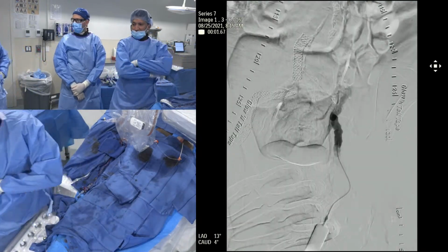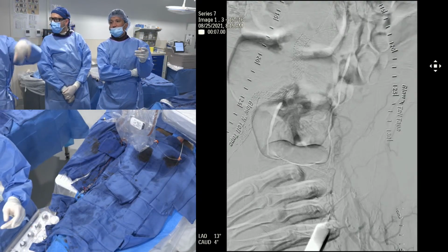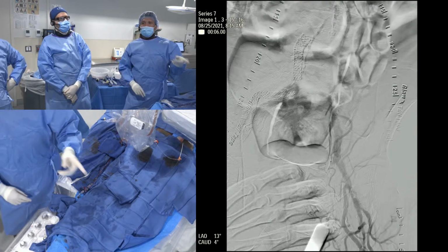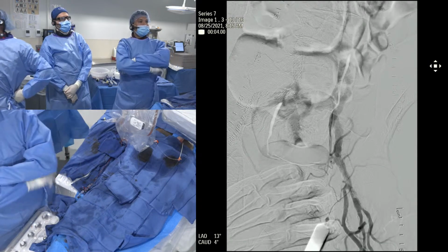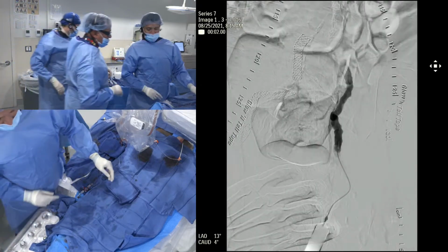The other option may be to put a short one up top and then a 7079 down below, because you can see here the internal lesion. You see it there, the external internal lesion. So that's another thing. So the 7.0 VBX goes until 11. All right, guys. Give us a 79. Let's measure it. So we're going to put a 79 in first.